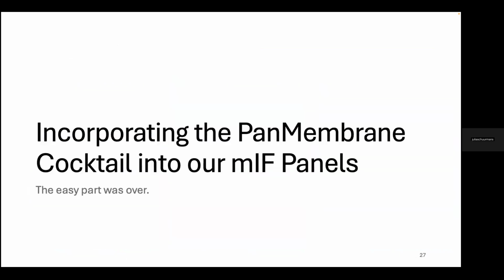Moving on to my next aim of my project was to incorporate that newly optimized dilute stain into a full panel of multiplex markers to see how that would work and hopefully remove the background staining that we were seeing with the initial PanMembrane stain.